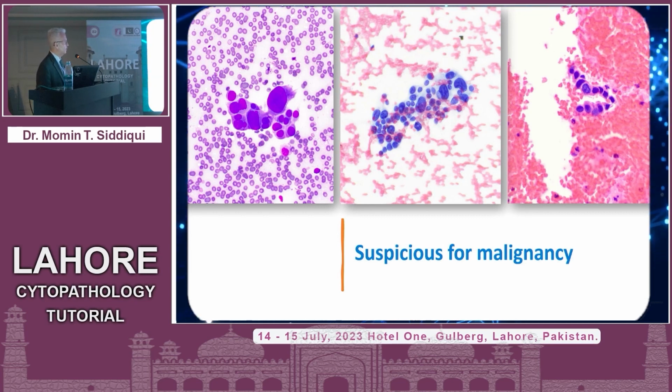And then this is the cell block, case number 3. Same features there. So this is what I would qualify as a suspicious for malignancy call. Each of these ended up representing an adenocarcinoma later on. But based on just this focus being noted on 3 separate cases, this is what I would want to give you as a benchmark for calling something as suspicious for malignancy.